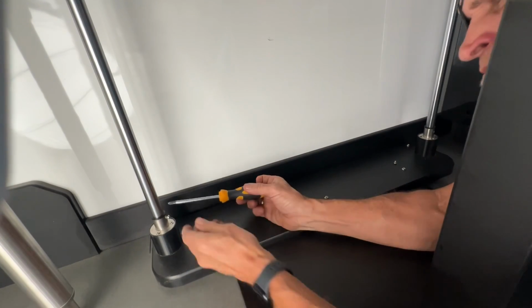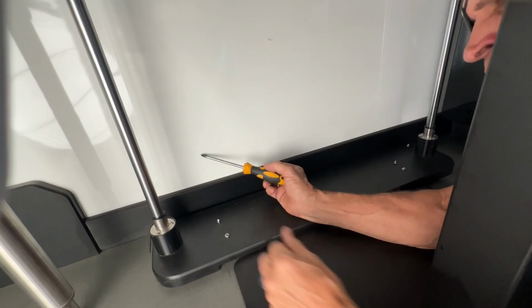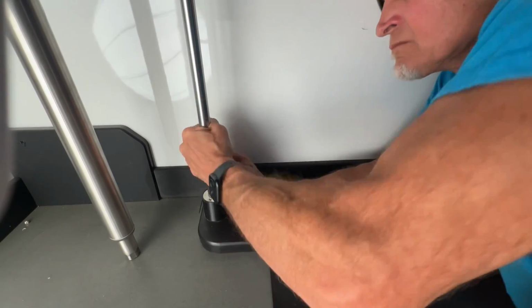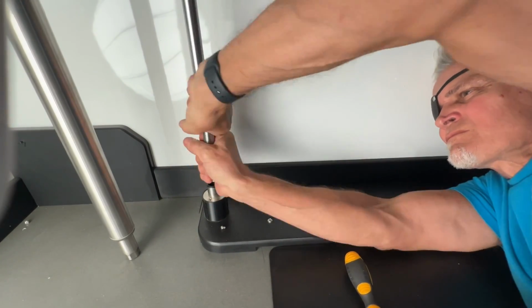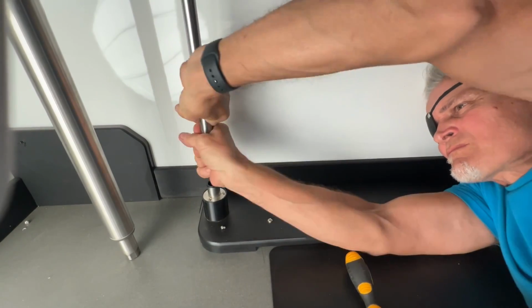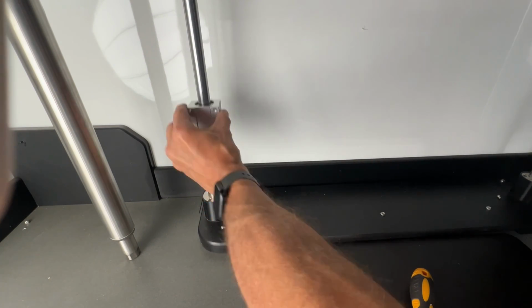Then we're going to locate the set screw on the bottom of the rail on the flange, and we're going to grab a Phillips screwdriver, and loosen this and also remove this screw and put it in a safe place. Now we're going to grab the bar and twist it back and forth, or in just one direction, and push up at the same time so that we can raise the rail high enough to give us enough gap between it and the flange to be able to put bearings on and off the rail, as you see me doing here.